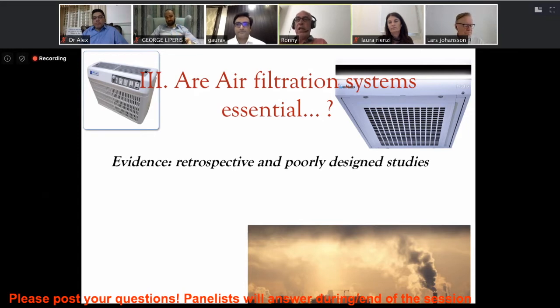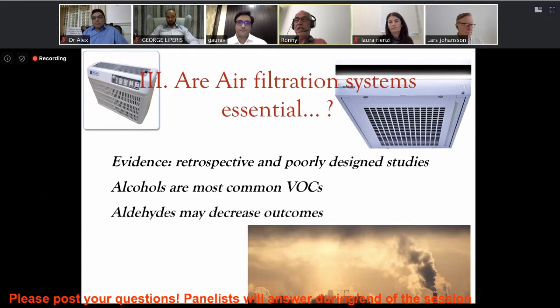Now, I would like to refer the audience to the Cairo Consensus on IVF Laboratory Environment and Air Quality. It's published in RBM Online. There is a list of publications there, and there is no single publication indicating the inverse, that it would not affect IVF outcomes. Now, which KPIs are affected? Again, that's a very, very difficult question.